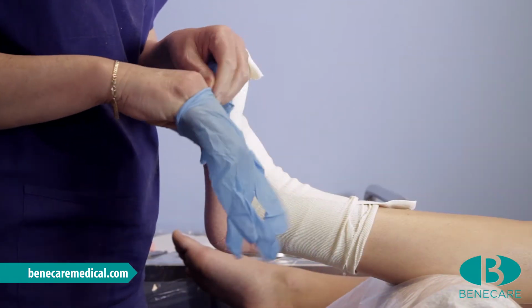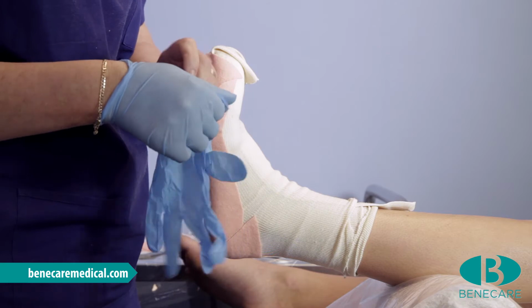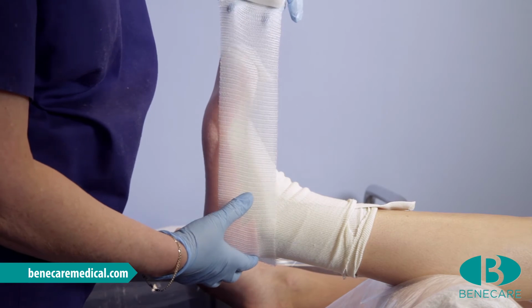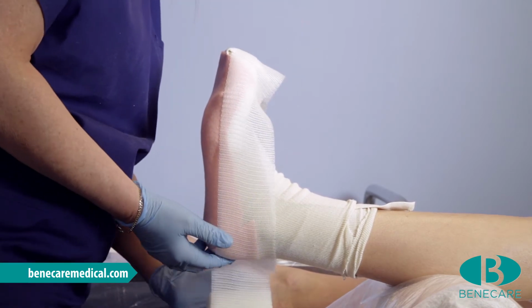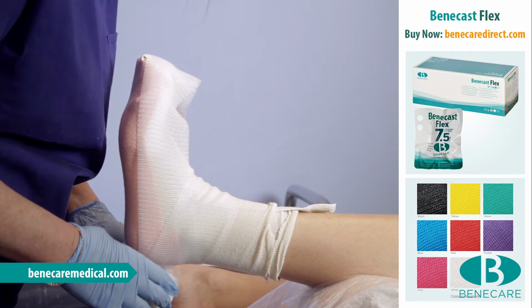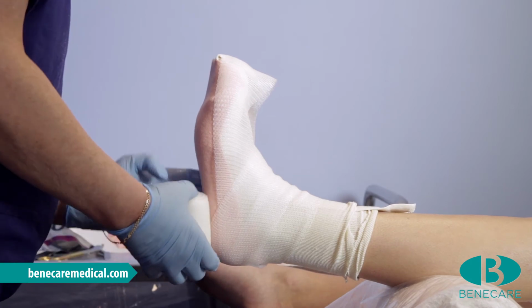I am now going to apply examination gloves, as these are required when using a synthetic casting material to protect my skin. Start by positioning the casting material at the posterior aspect of the heel and work along the foot longitudinally, keeping the material parallel with the plantar aspect of the foot. Continue across the apex of the toes, down the foot under the heel.